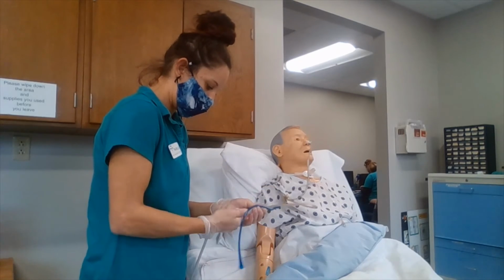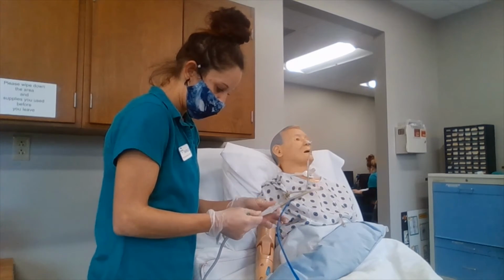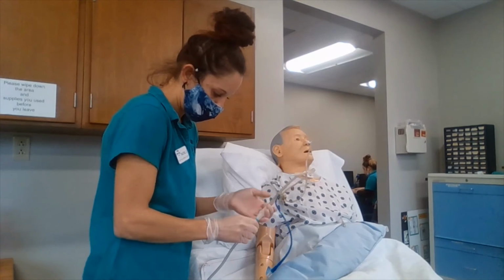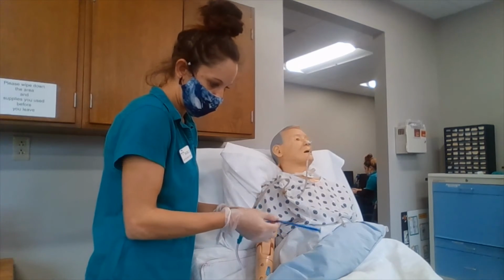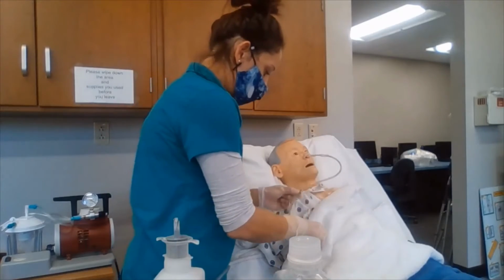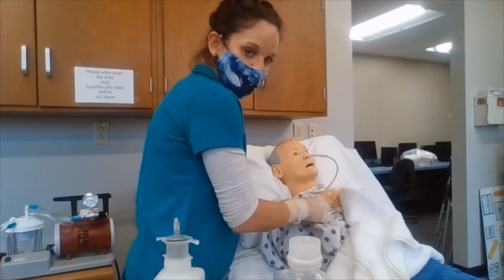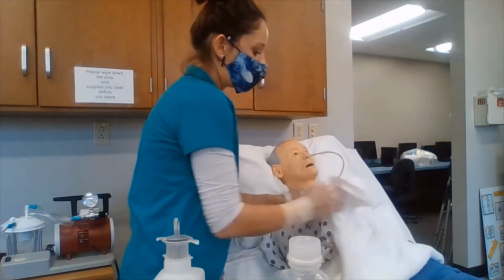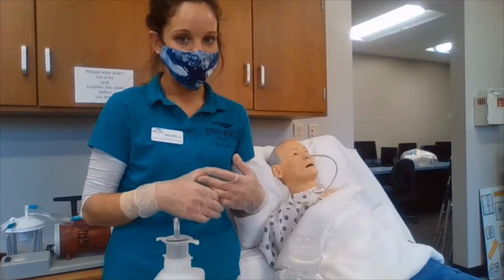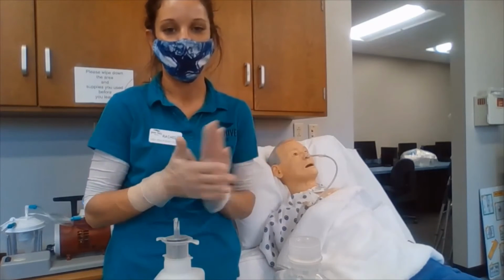When we're suctioning, we are connecting the tubing to the suctioning. We are going to be using this little adapter to connect it into the suctioning. This is the air filter or air vent. We are pinning our rubber band back to our patient's safety pin on their gown. We are going to make sure that we are providing comfort measures and that we are disposing of everything properly, and we take off our gloves and wash our hands.